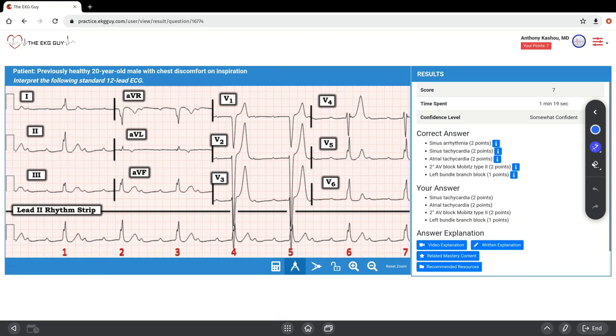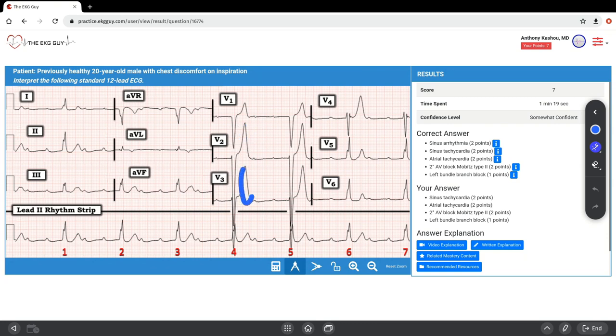Also notice markedly peaked T waves above 20 millimeters in amplitude in leads V2 and V3. These two here are quite peaked, quite large as well. That could suggest hyperkalemia. In this previously healthy male, we would probably not diagnose hyperkalemia without additional information. In fact, this patient's serum electrolytes were normal.